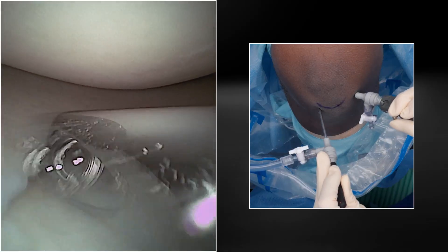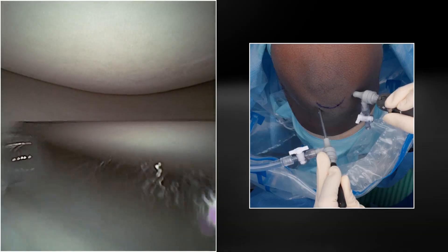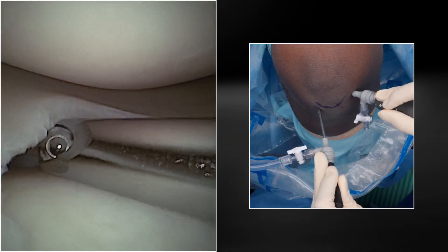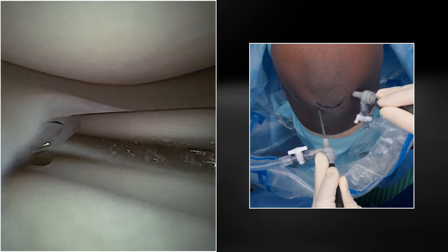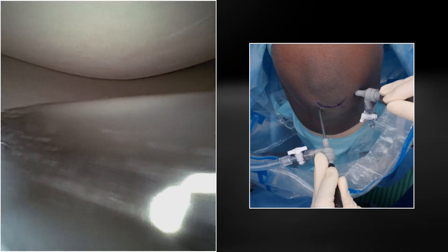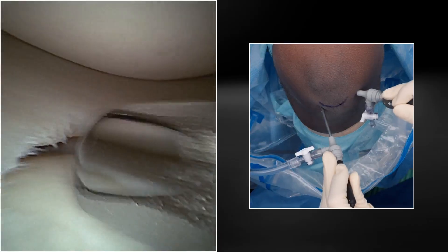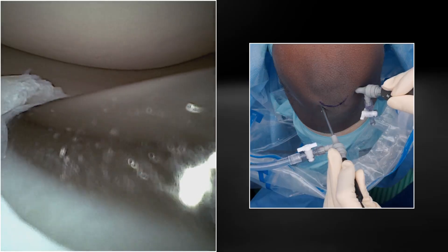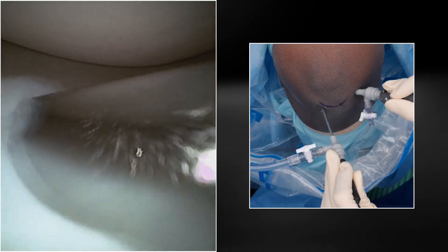Next, we're going to check out the Nano Shaver. It's a 2.8-millimeter shaver. This is not new for the 2.0 system, but I love this tiny shaver. I use it in all of my knee scopes because it can get all the way in the back, which is where all of the degenerative tears typically are. This is just the shaver finishing our debridement here in the body. And again, we have not touched the cartilage once so far.